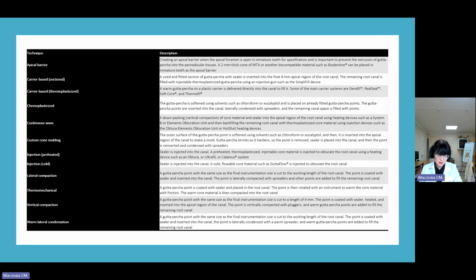Methacrylate resin root canal sealers first appeared in the 1970s. As existing root canal filling materials didn't bond to root canal dentine, methacrylate resin sealers were promoted as being adaptable and bondable, creating a monoblock system. Many generations of these sealers have since been developed.